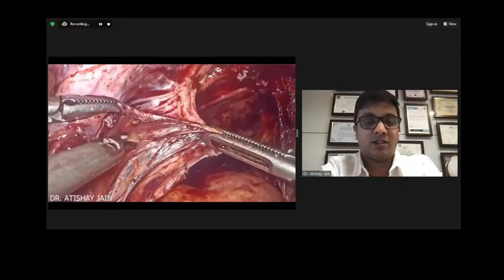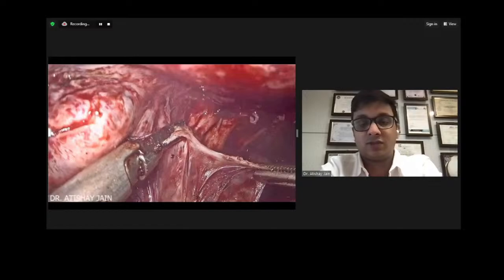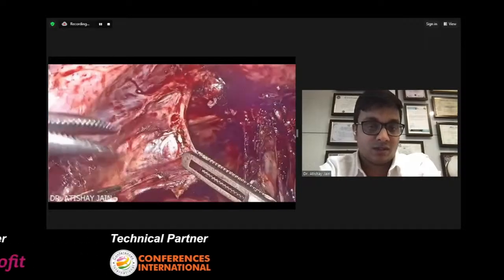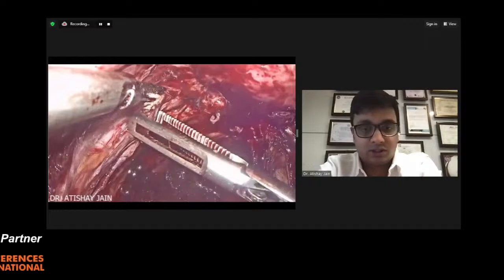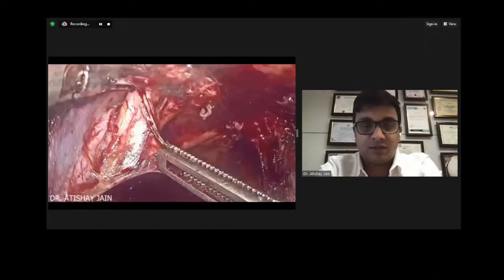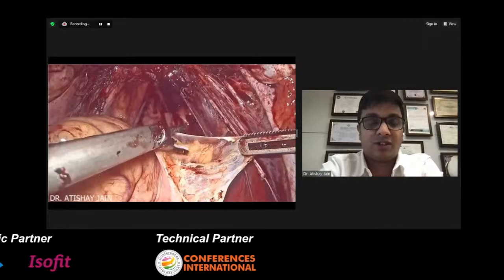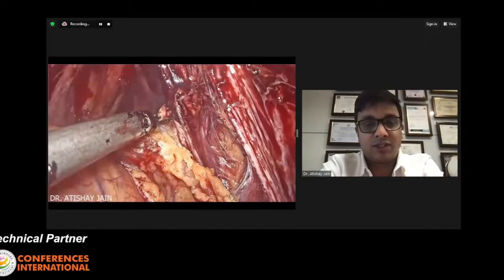And once the ureter enters the tunnel, then you can start going medially towards the uterosacral and the rectovaginal tissues, the rectovaginal area. So here, as you can see, the ureter is being mapped, and we're going down towards the tunnel of the ureter, and then we'll turn around medially, and then we can start on the lateral side of the rectum in the pararectal spaces. Here we can see the inferior hypogastric nerve in most of the cases, but don't try too hard to look for it because you might just end up damaging it.